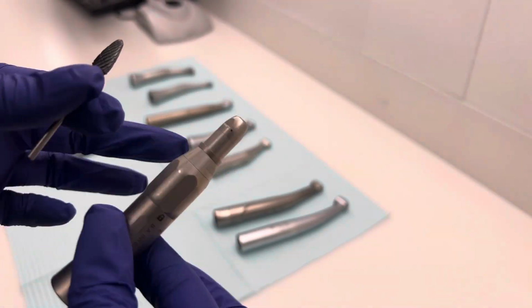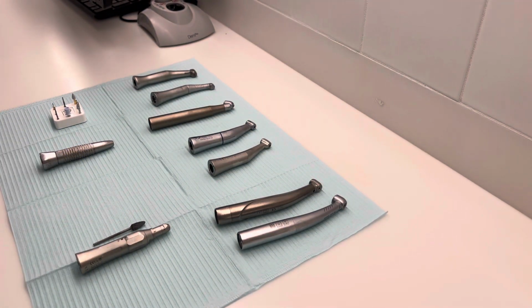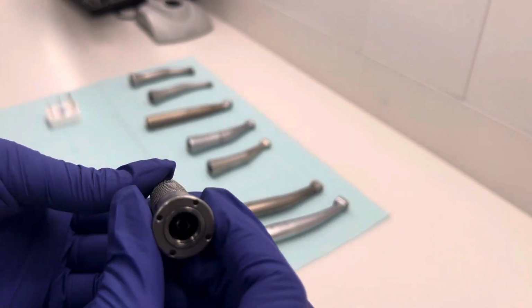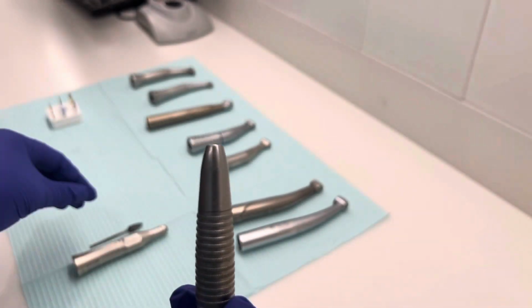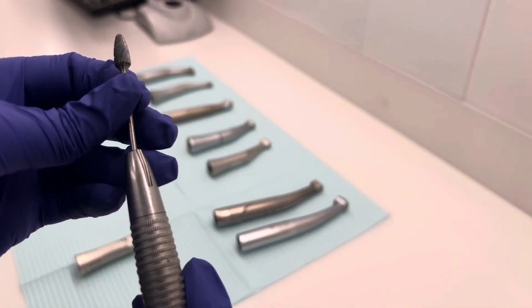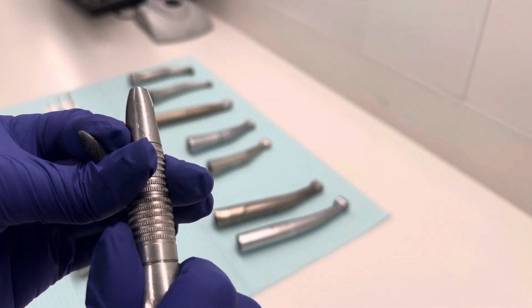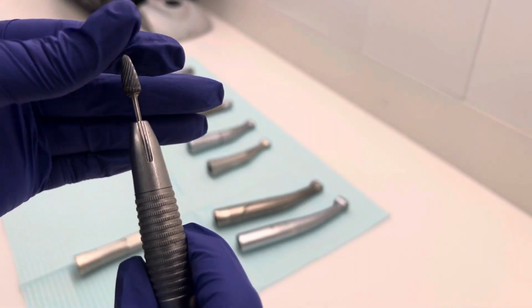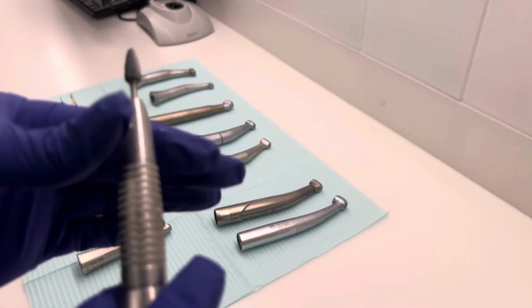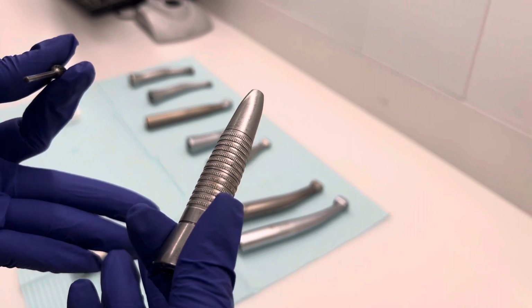It's as easy as that, but just in case you didn't get it, I'm going to show you a different kind of straight hand piece. They come in different brands and types, and this is also one of those. It's as short as the other one, as you can see. Same application, put it in and you twist. So you have to check if it's open or closed, because if it can't go in, then it's probably closed. Slide it in, close, make sure it's firmly placed inside, turn it the other way and open, and there you go. It's as easy as that.